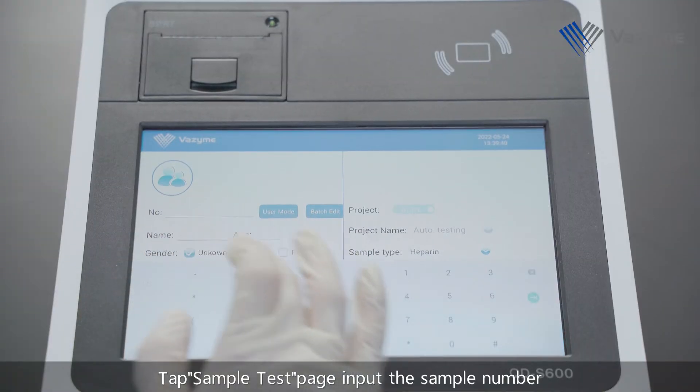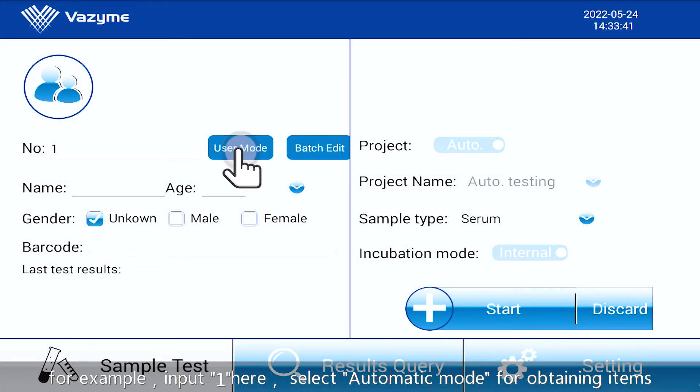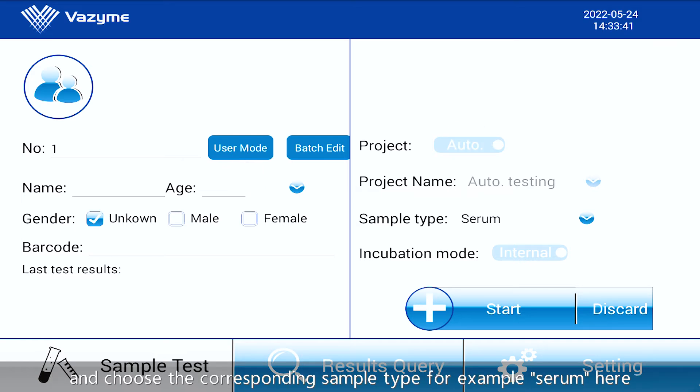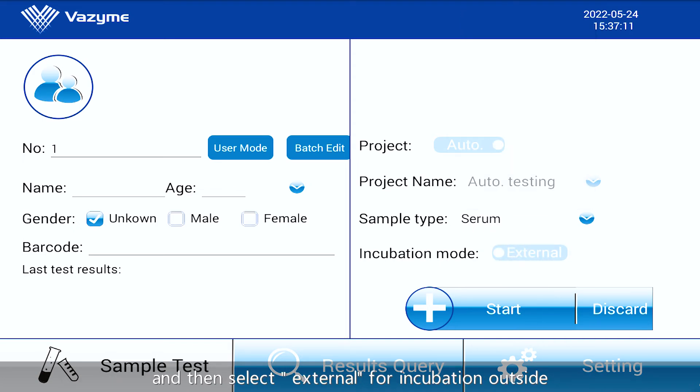Tap Sample Test Page. Input the sample number, for example 1. Select Automatic Mode for obtaining items and choose the corresponding sample type, for example serum. Then select External for incubation outside.